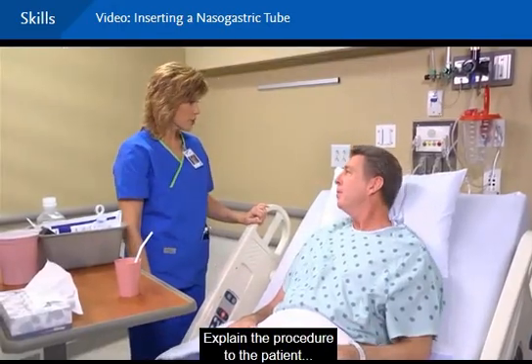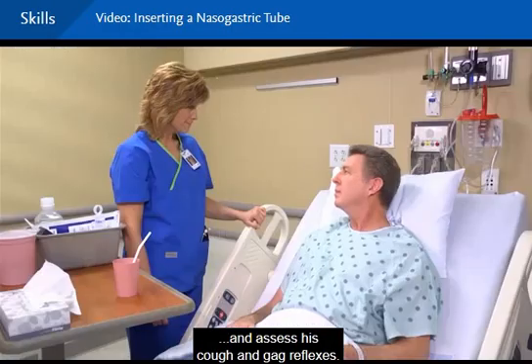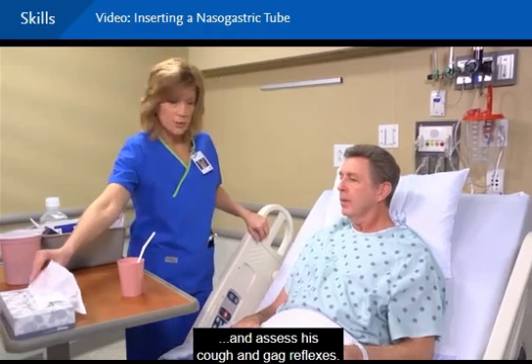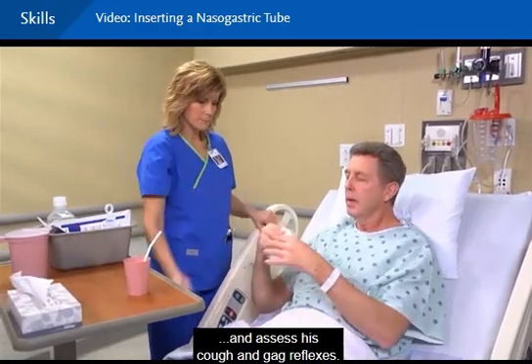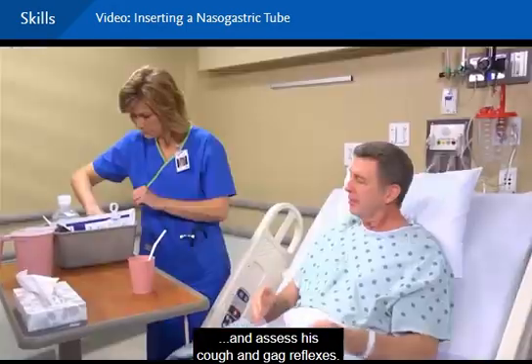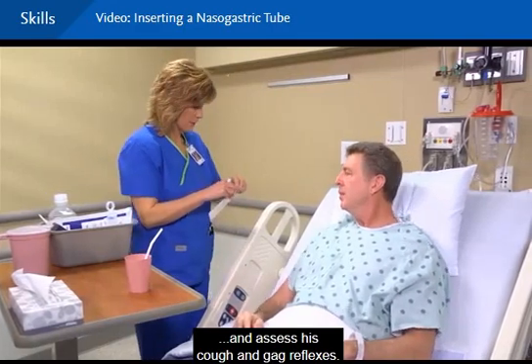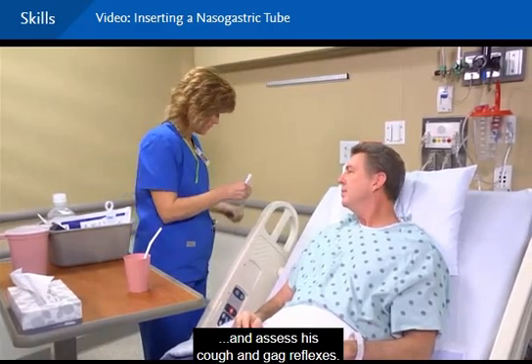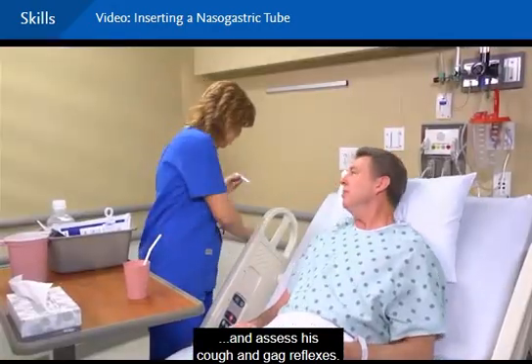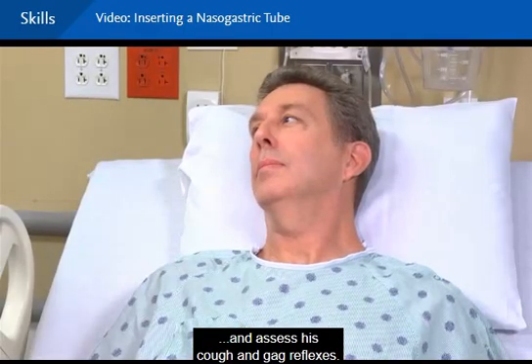Explain the procedure to the patient and assess his cough and gag reflexes. All right, I'm going to assess you for a few things before we get started. I would like you to cough for me, please. Very good. And then I'm going to assess your gag reflex. Thank you. Sorry for that discomfort. It's okay. I'm going to raise the head of bed for you now.